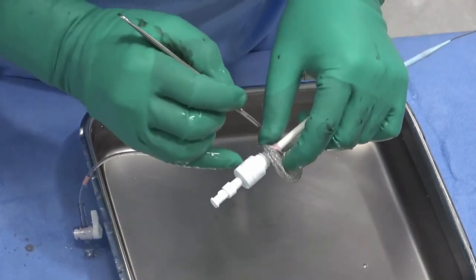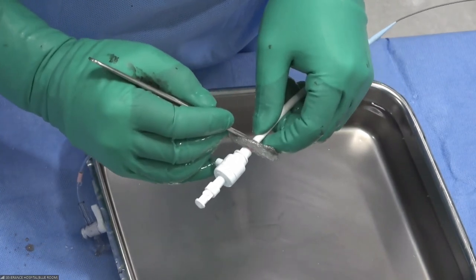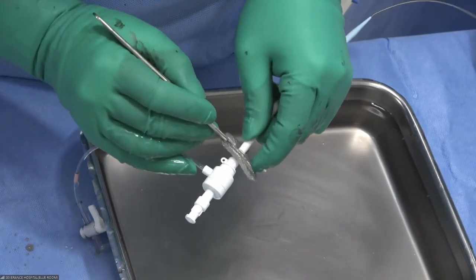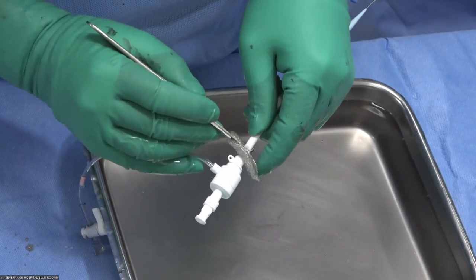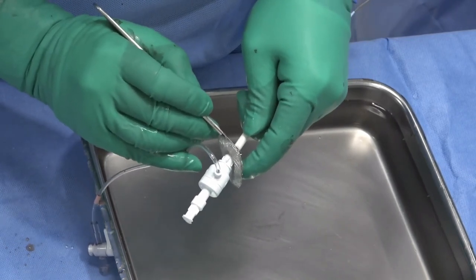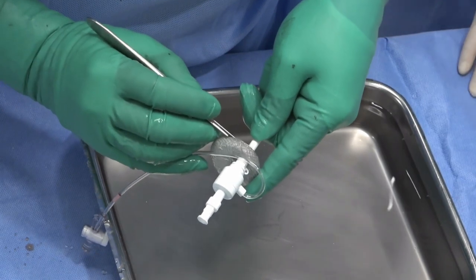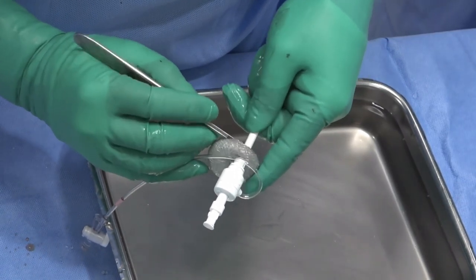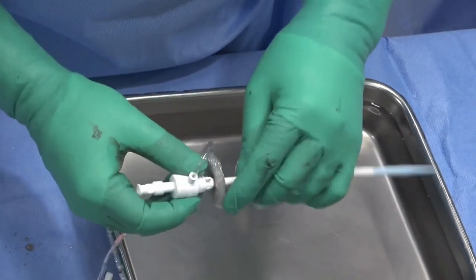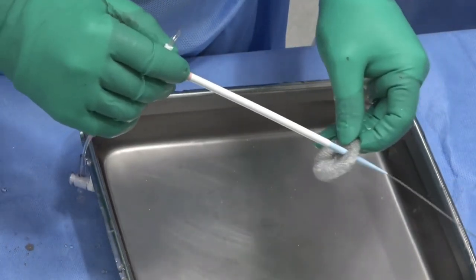How many minutes do I have? Some. Peter, don't cut your finger. So you're going to do umbrella sizing, right? You started with 24, now it's 26, and the next will be 28? Yeah, actually, one bigger size has worked in all of my experience. Sometimes, when I was proctoring in another hospital, it didn't work. So we looked for the cause, and I found they had torn the septum.